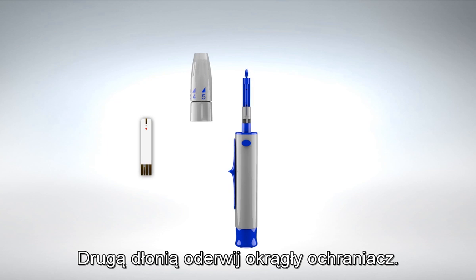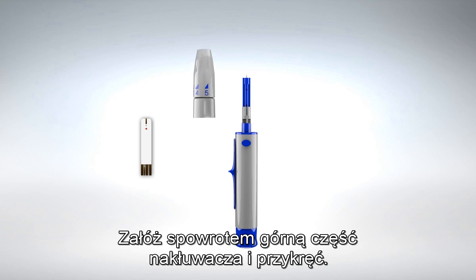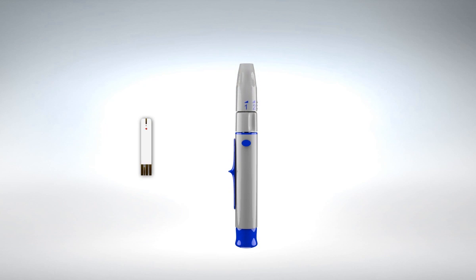Use your other hand to twist off the rounded top. Then place back the top part of the lancing device.